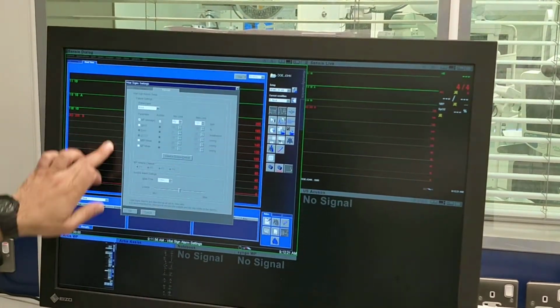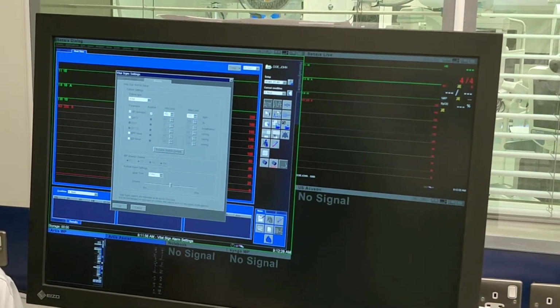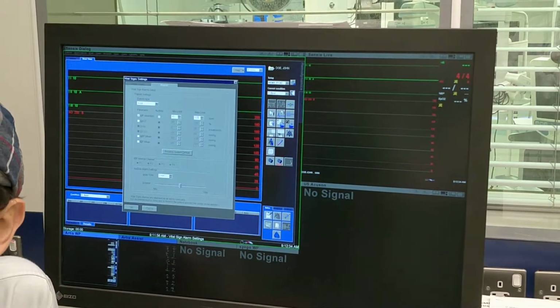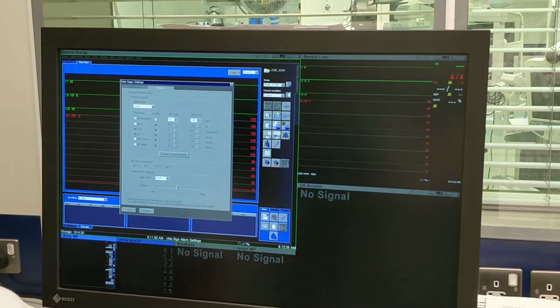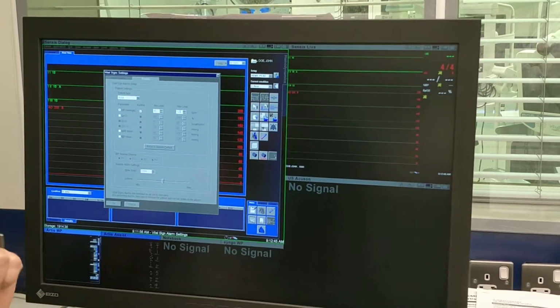The reason why the alarms came, because the doctor comes and he says, look, this machine is so noisy. Why is it noisy? Doctor, because your patient's heart rate is 44. I know, it's normal. He's bradycardiac. Okay, doctor, the machine alarms. Come on. You know, and then they keep on. So what happened? You can change your limits depending on your patient.